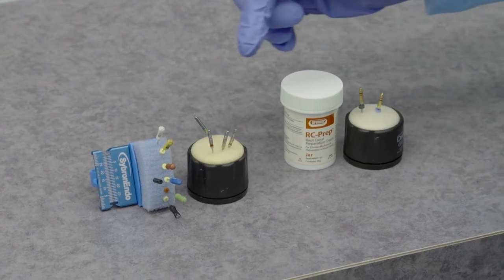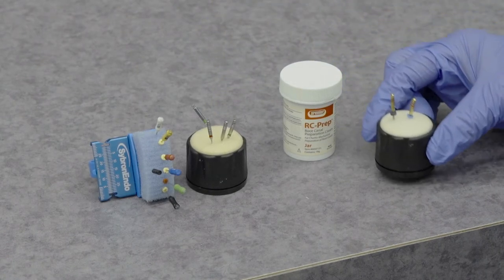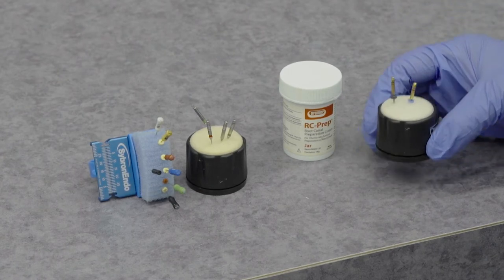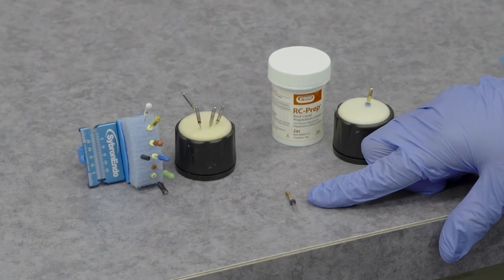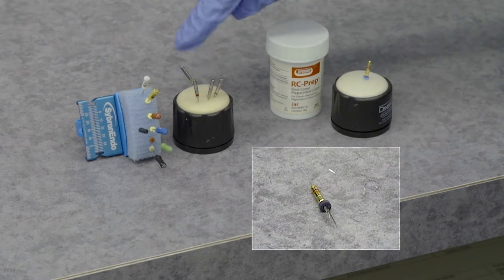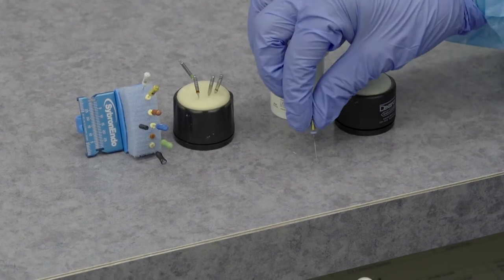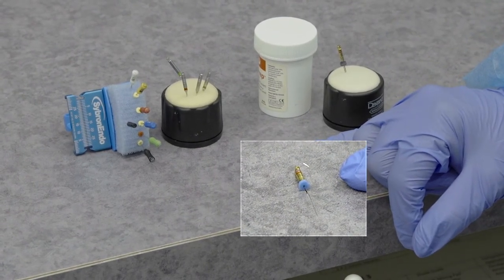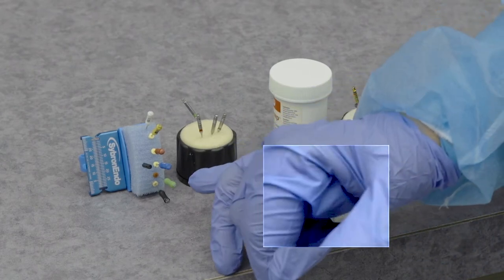And in some dental offices, rather than using the file system with the Gates Glidden, some offices will use rotary instrument systems. In this case, I have an example here of a rotary system. One is called an endodontic flaring, and it opens up the endodontic canal just the same way as the Gates Glidden does. And we have an endodontic rotary file that would be utilized the same way, except within a handpiece that's special for root canal in place of utilizing the file system.